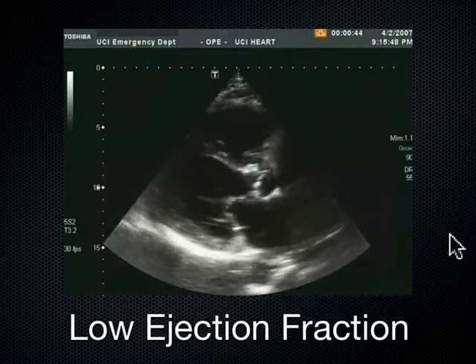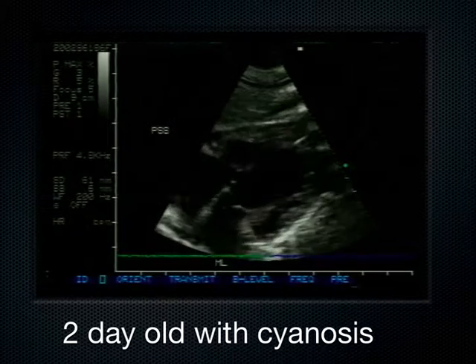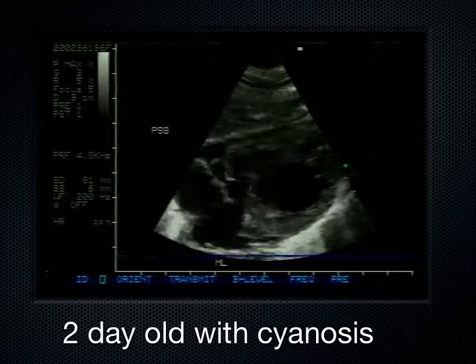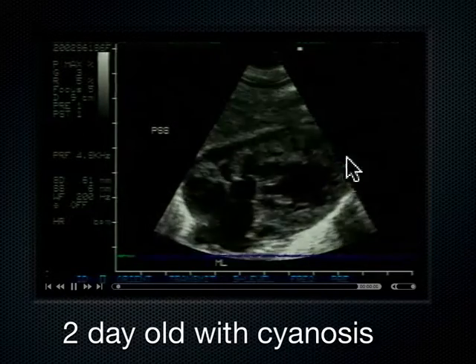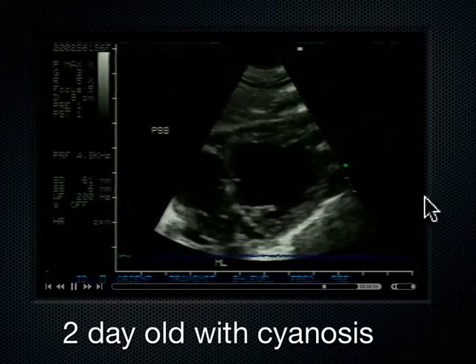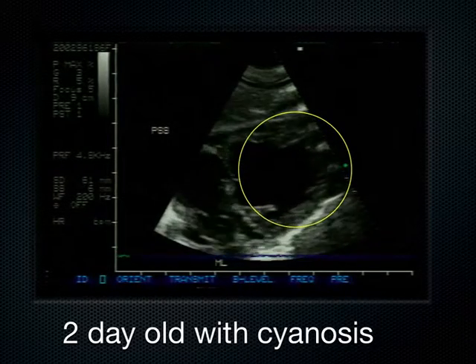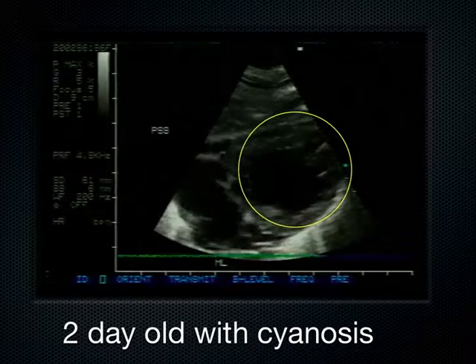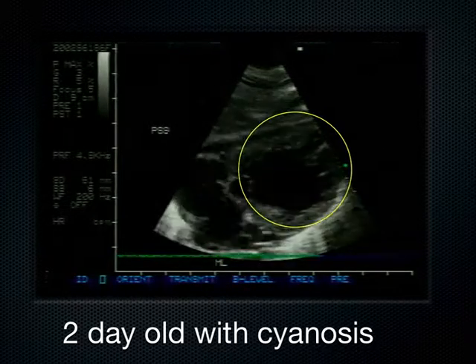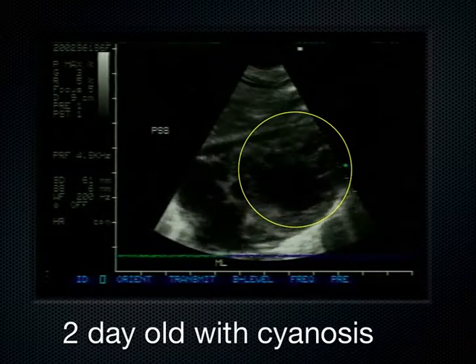Any questions about kinesis before I move on? This was a two-day-old that came in when I was doing my fellowship at Christ Hospital in Chicago — came in with cyanosis. We did a sub-xiphoid view of the heart. This is the liver, these are the atria, and this is the single ventricle. The differential diagnosis of a cyanotic neonate is pretty big. This happened to be a congenital heart defect, and so we were able to very early on appropriately disposition the patient and call the right people. The patient survived — we wrote it up as a case report.